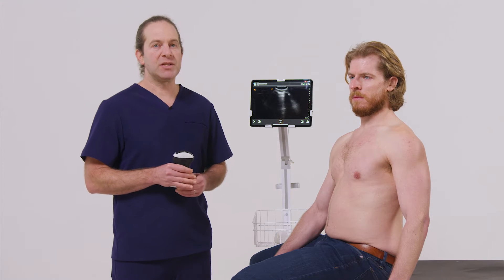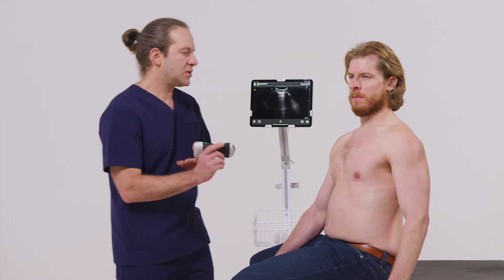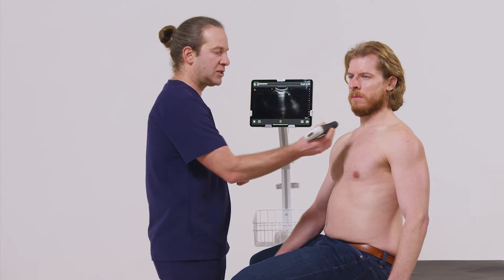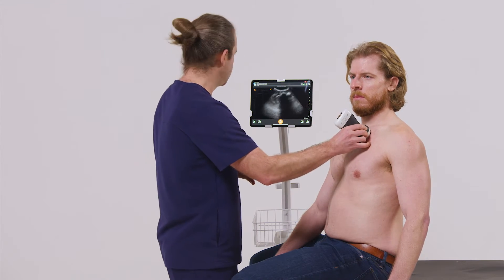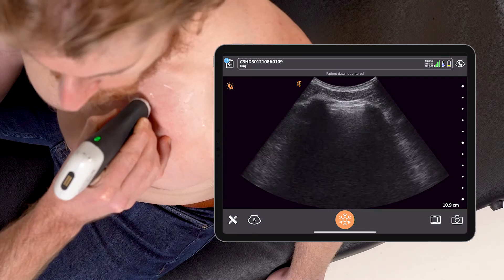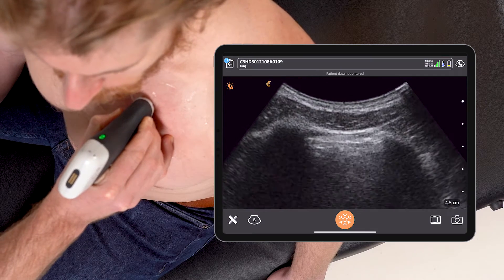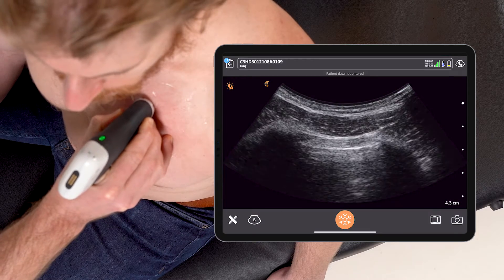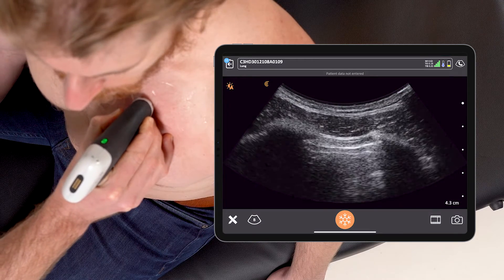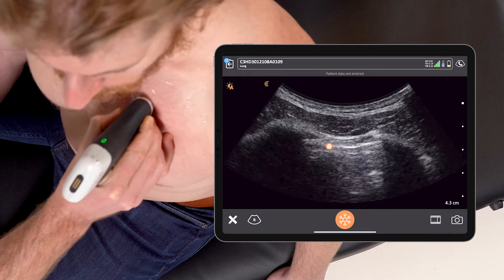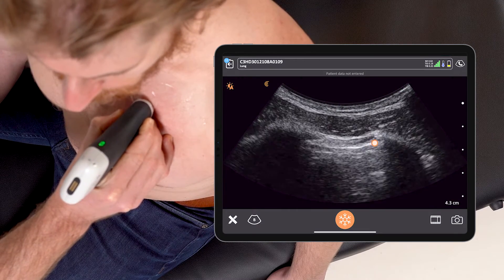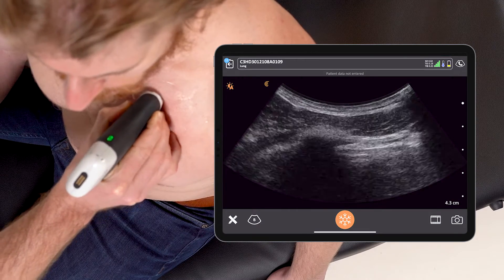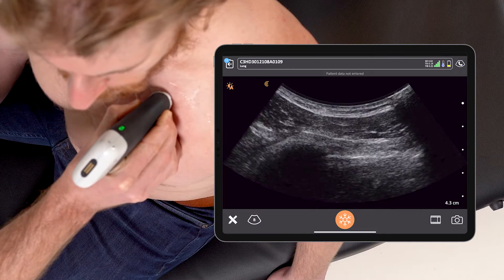To perform the scan, I'm going to use a C3 scanner, starting here on the anterior thorax. I'll zoom in and decrease my depth to really identify that clear, sharp pleural line and sliding. Make sure there's no sign of pneumothorax.